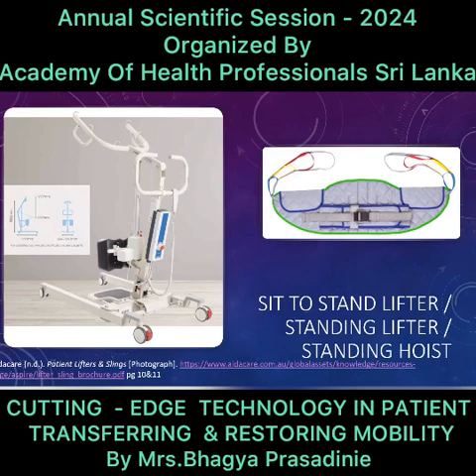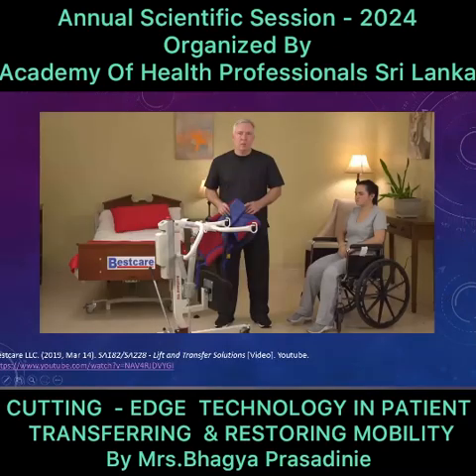So with the standing hoist, you can get a resident up from the sitting position to the standing position. This is called a sit to stand lifter and standing lift as well. So we'll quickly go through the video.